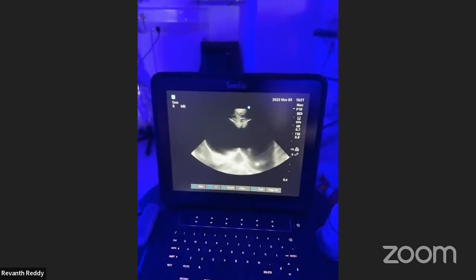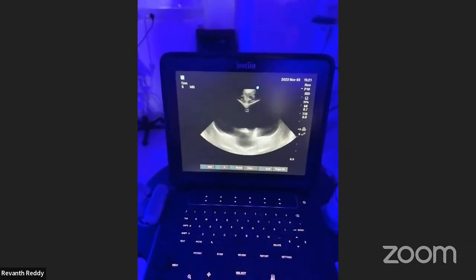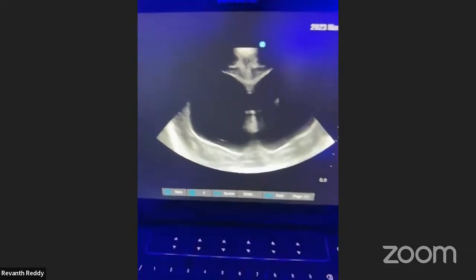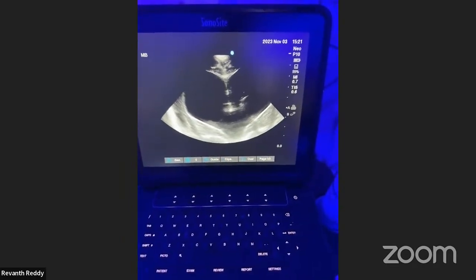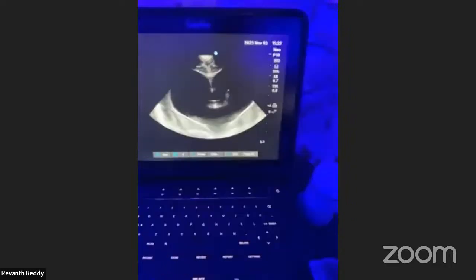for this baby. This is showing the dilated fourth ventricle. This baby is having an Ommaya reservoir, an external ventricular device, and we are regularly tapping the CSF for this baby, and plan to go for the ventriculoperitoneal shunt once the infection, that is the protein level, comes down.